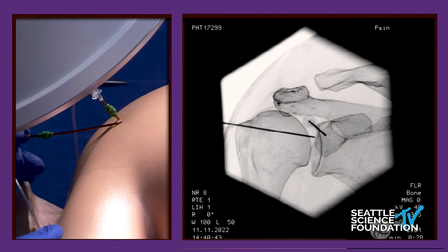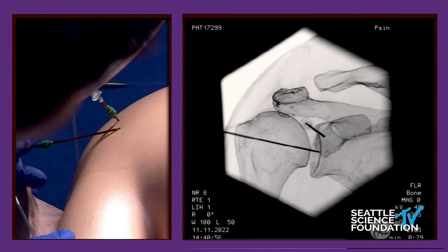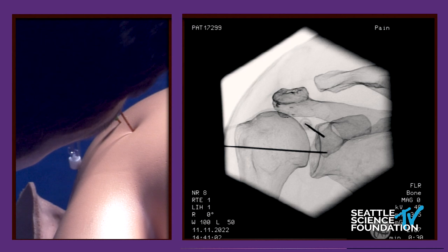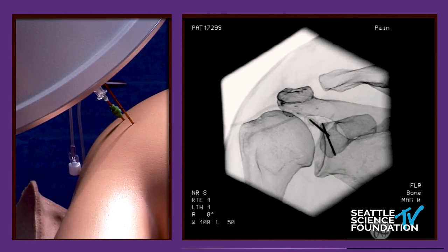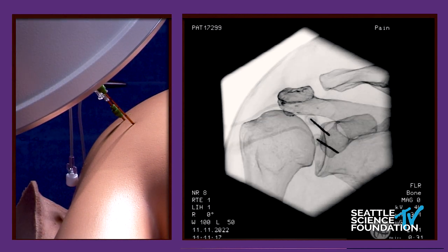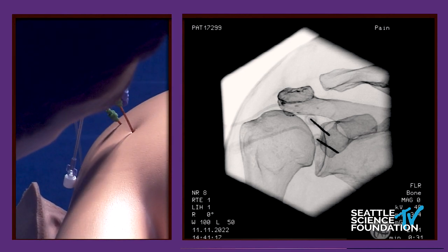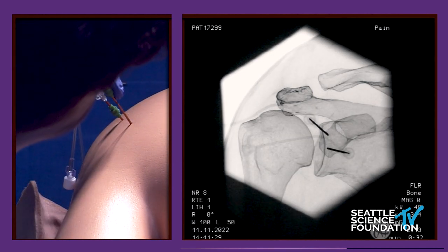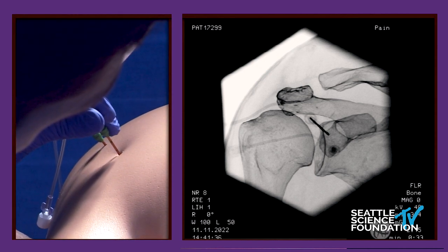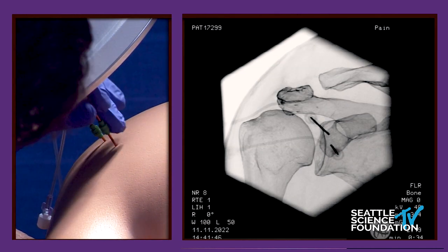And then with the second needle, he's going to bring that about a centimeter caudal or inferior to that other needle. So a little bit more medial here. And as long as your tip just ends up there on the bone, you could go even a little bit more medial. Just a little bit more cephalad and a little bit more lateral, and when you touch bone, that would be great. So that's perfectly coaxial — I like that. That's a beauty. If you're touching down on bone, I would be very, very happy with that. This picture gives you a good view of that hub and what the lesion would look like.